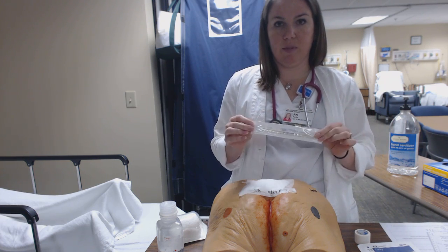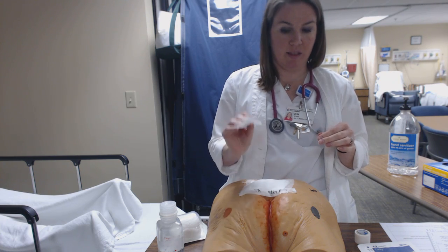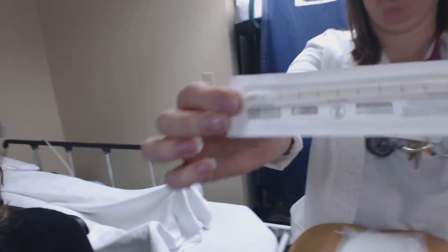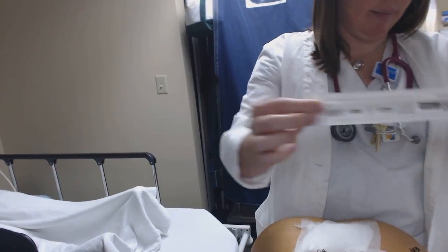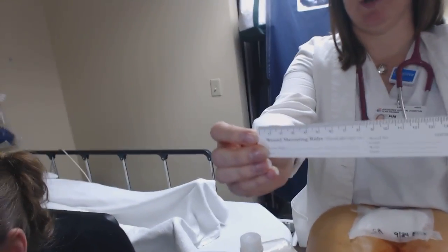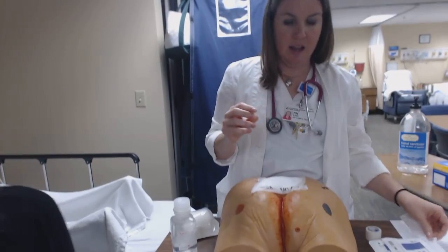I have sterile Q-tips so we can measure that tunneling in the wound and measure depth and width, which also has a measuring stick here on the package that you can use. But because I'm afraid I might get too rowdy and pull that apart and rip it open, I also have this measuring stick here that we can use. So both of those are available for my use, and I brought both of them.